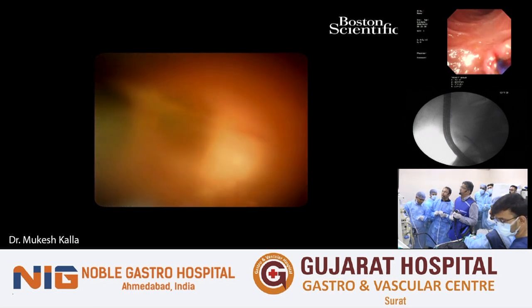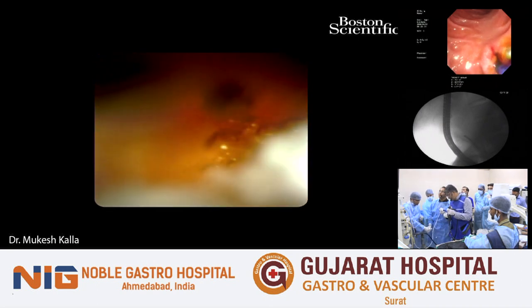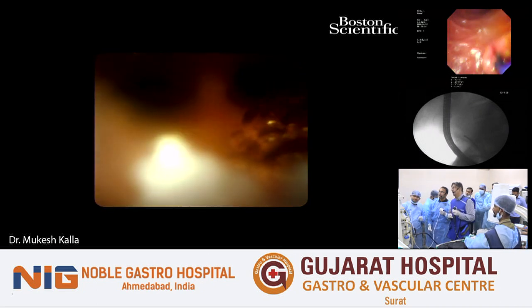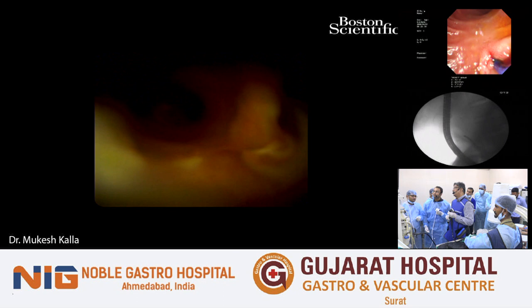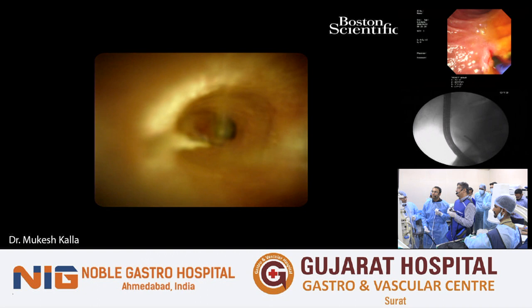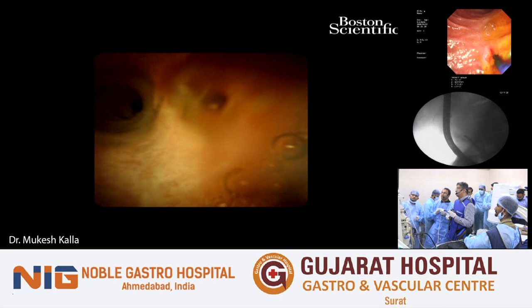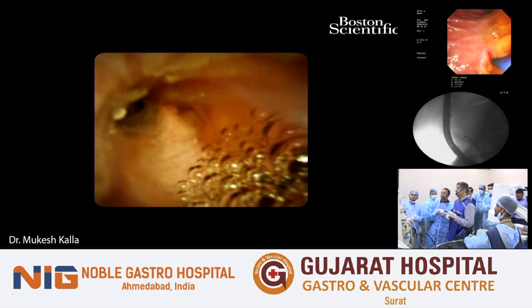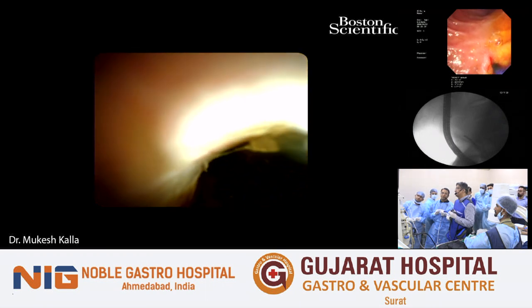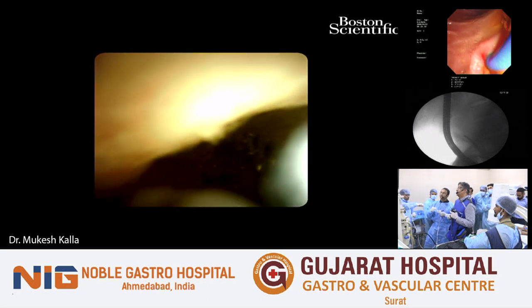Yeah, I was also going to talk about just a little point about papilloplasty or sphincteroplasty prior to spy. I personally do recommend putting it over a guide wire or freehand after a papilloplasty is performed, because we've had a case of perforation when there was a narrow distal bile duct and we were trying to manipulate it freehand. So after that episode, we've decided to absolutely do papilloplasty or sphincteroplasty. Even if it's a stricture case, we do a short, small papilloplasty and then proceed with the spy advancement if it's freehand.